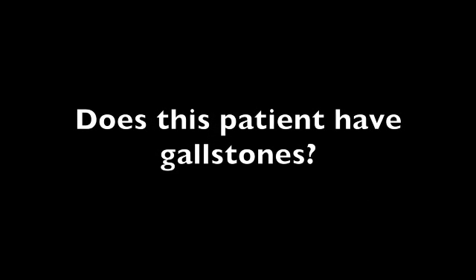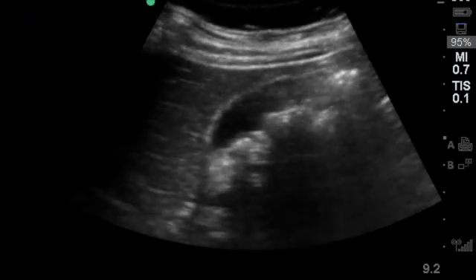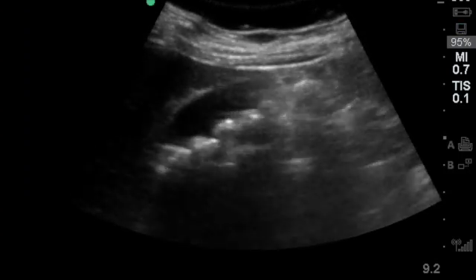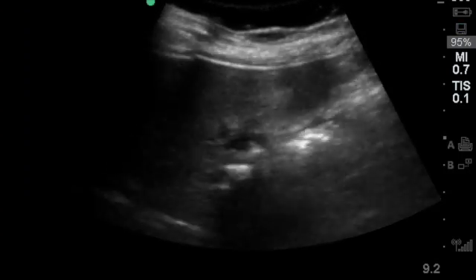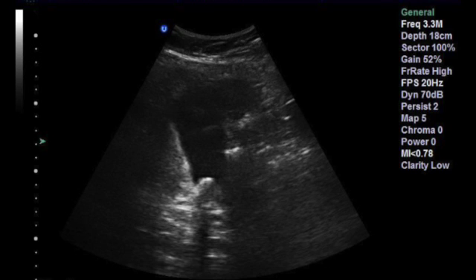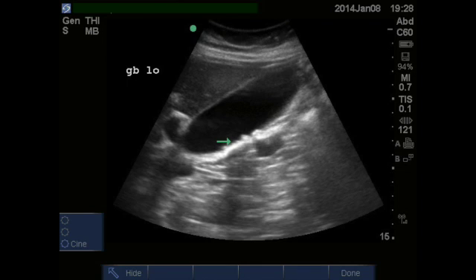Speaking of stones, that is the main question you are answering at the bedside. You are looking for anything irregular and hyperechoic in the gallbladder. Stones generally have shadowing like this. They can be big, small, or tiny, in which case they may be called sludge.